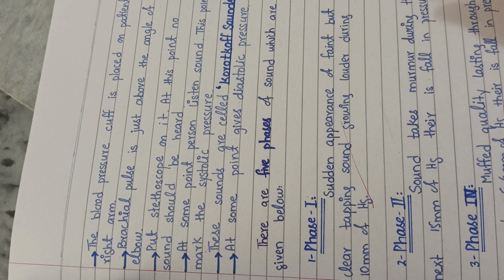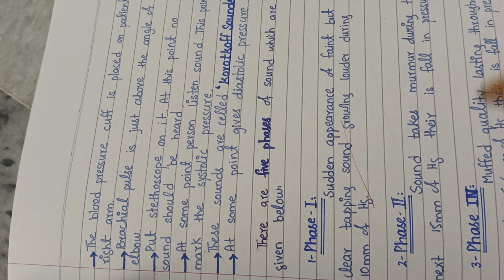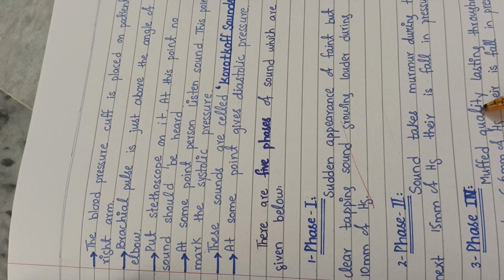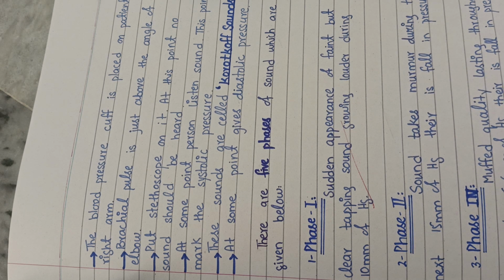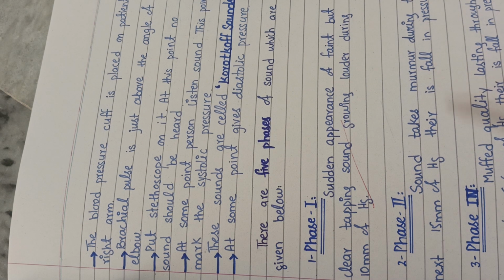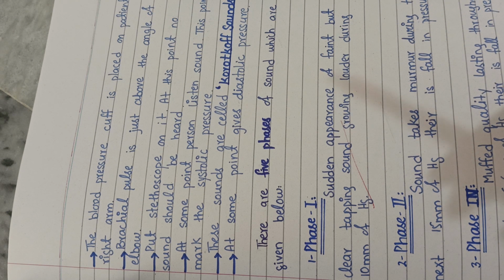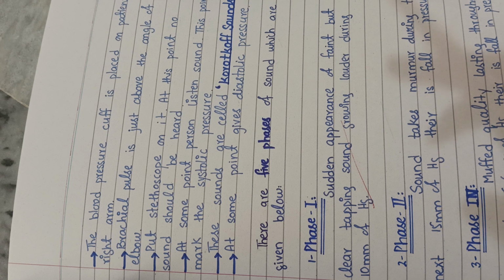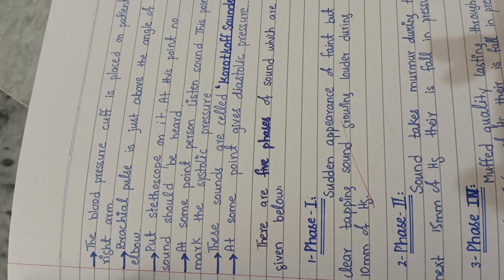In the third phase, your sound is going to be louder over the next 15 mm of Hg, and in the fourth phase, your sound again becomes muffled and a murmur over 5 to 6 mm of Hg, and in the fifth phase, complete silence occurs. You will hear no sound. So these are the five phases in which you hear these sounds, and by these sounds you detect your blood pressure.